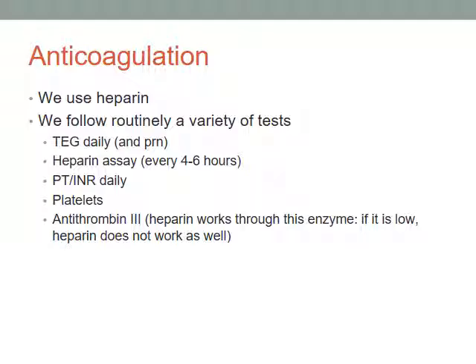You look at the patient, how are they doing? Are they oozing from the cannulas? Are they having more clot forming somewhere? Well, if they're oozing, we've got a problem. If they're forming clots, we have a problem. So you've got to make adjustments. Is the oozing because you need another stitch? Or are you oozing because you have a coagulopathy? Are you clotting because you've got low flow? Are you clotting because you're thrombotic?